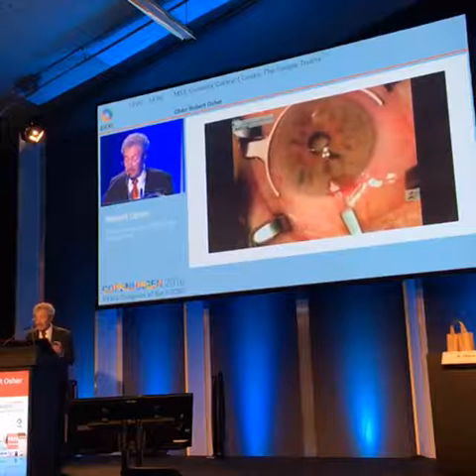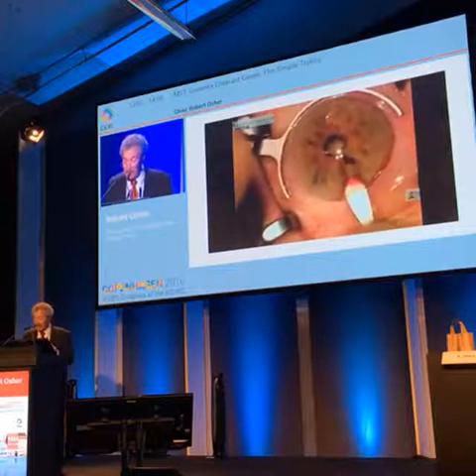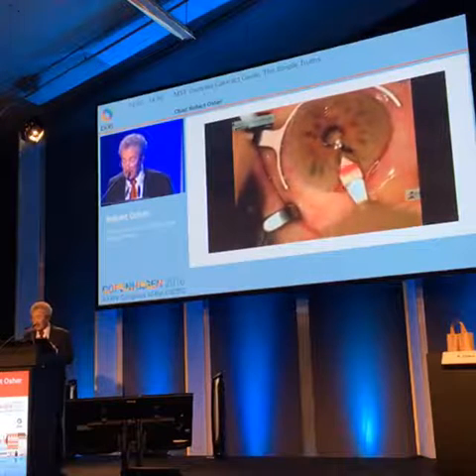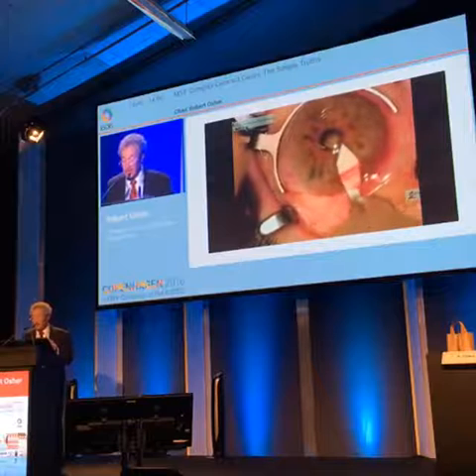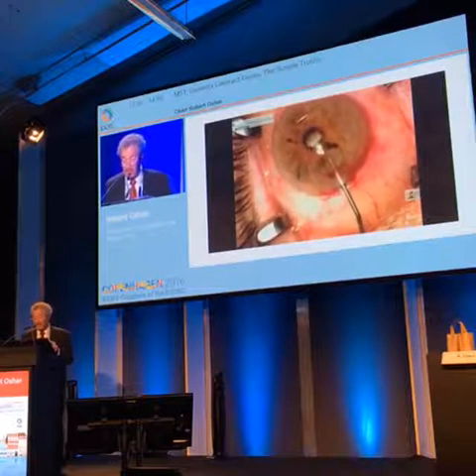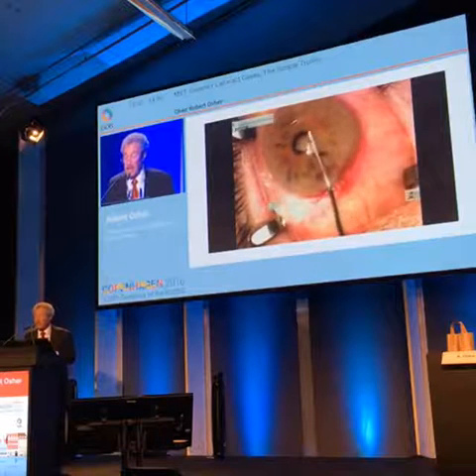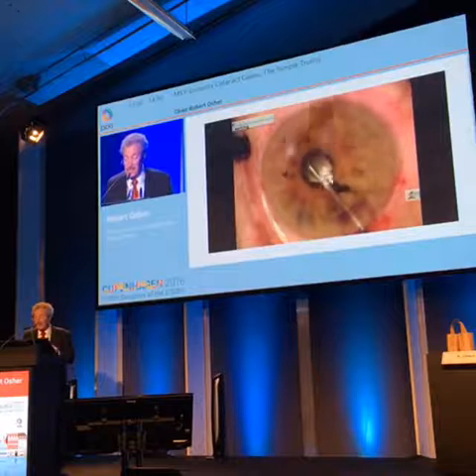removing that subconjunctival anesthesia. I like to make a groove. I go uphill with the diamond, I go downhill, and I flare the inside. So I'm 2-2 on the outside, 2-4 on the inside, and that little flare is great. Now the eye wants to collapse because it's nanophthalmic, and I'll perform the synechialysis next.